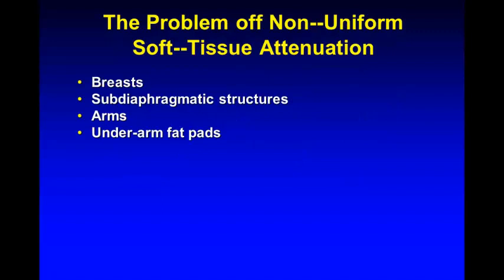All right, so I don't need to tell this crowd about the issue of attenuation. When we get our hands on our front head and try to look at this, is this attenuation or is this real? The problem is this issue has created another nickname for our field. I can tell you, coming from the other side, what my colleague cardiologists call me: oh, you're the unclear guy, not the nuclear medicine guy or nuclear cardiology guy, you're the unclear guy.